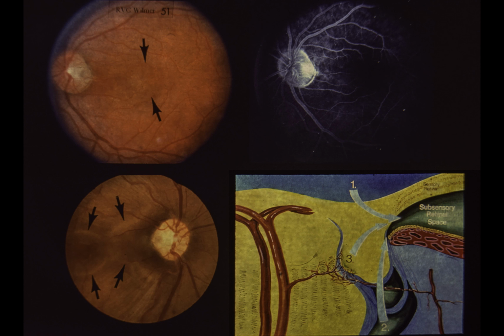Xenon arc photocoagulation was applied to the temporal border of the pit in an effort to seal the sensory retina and pigment epithelium to the optic disc border. 2 months later, there was some reabsorption of subretinal fluid, and visual acuity improved from 20/60 to 20/40. 5 months after photocoagulation, visual acuity again fell to 20/60, and fluid reaccumulated beneath the macula. Additional photocoagulation was applied, but visual acuity remained at 20/60, and the retina remained detached.